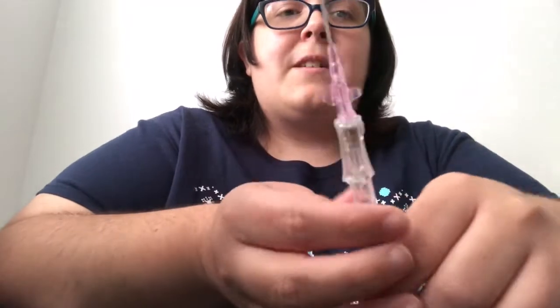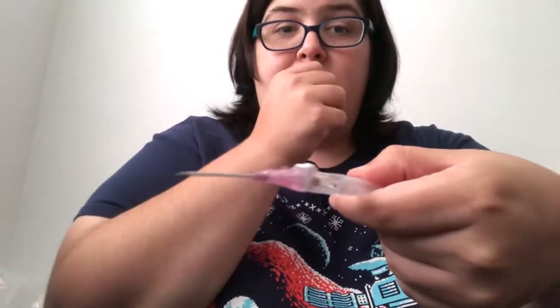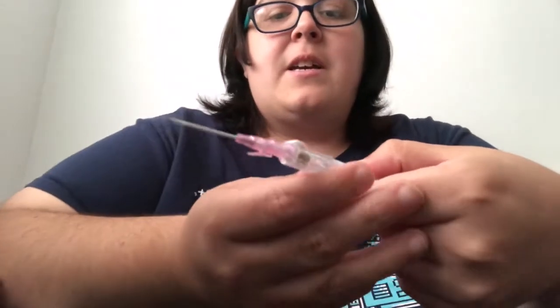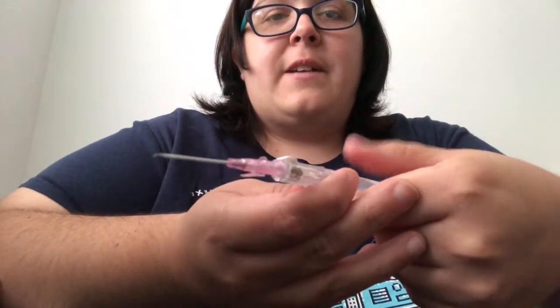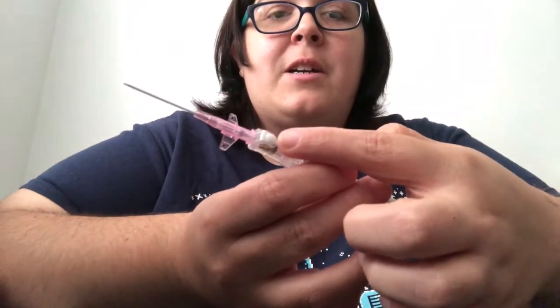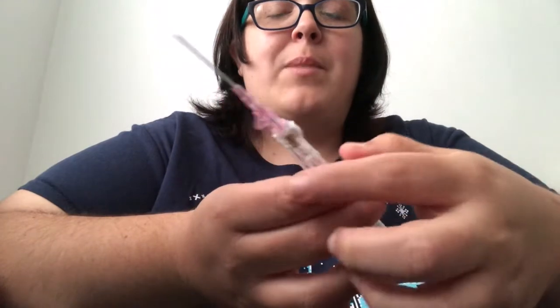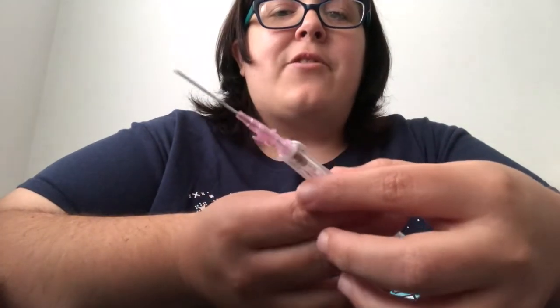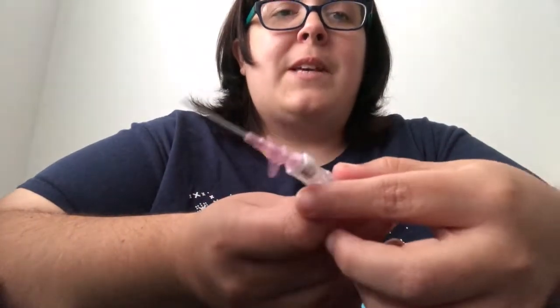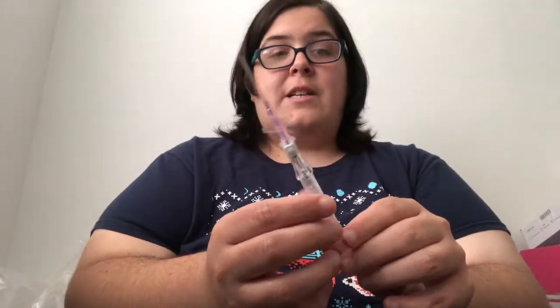Now, when you are done, once you have the IV inserted in the patient, this actually has a really cool safety feature. Now you see this little white button here. I'm going to show you what's going to happen when you hit this white button, but I want you to actually be able to see it good. So I'm going to flip the camera around in order to show you, so that you can actually see.